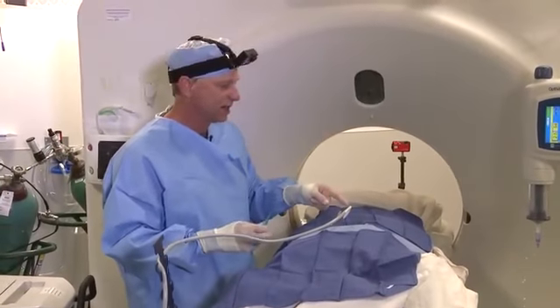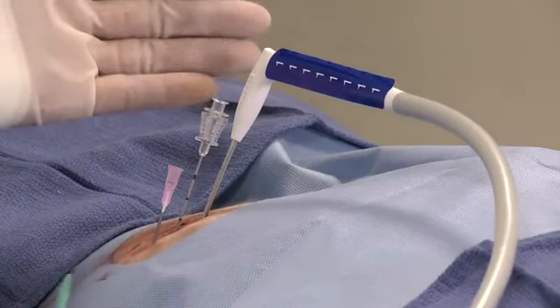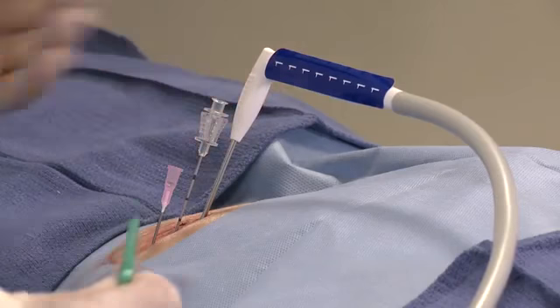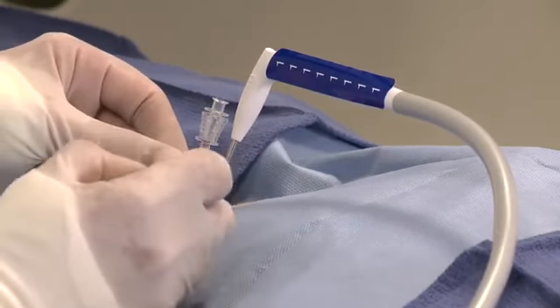We have a stick option here. We could run argon through this and stick it. The Endocare will suggest that, but if you've got gravity working for you, I haven't found that necessary, and it's a way to preserve your gas, so I don't bother with the stick mode.